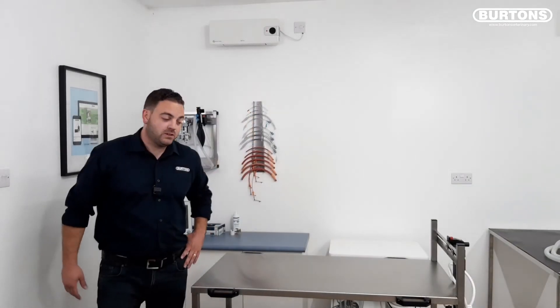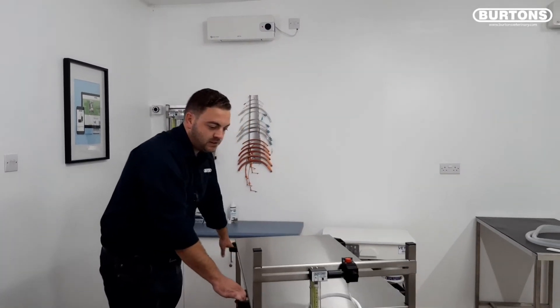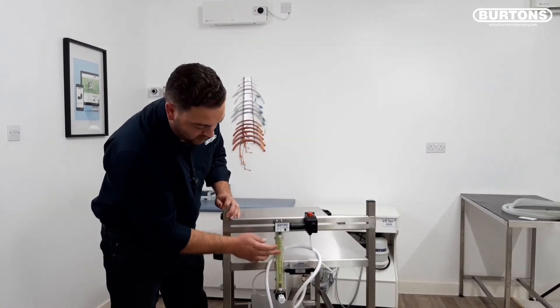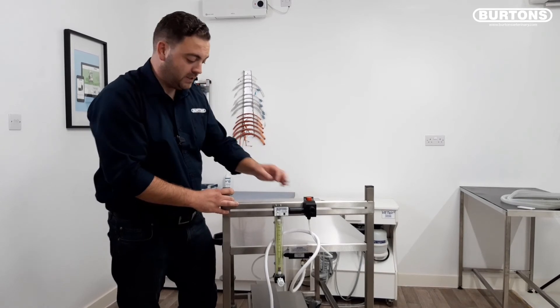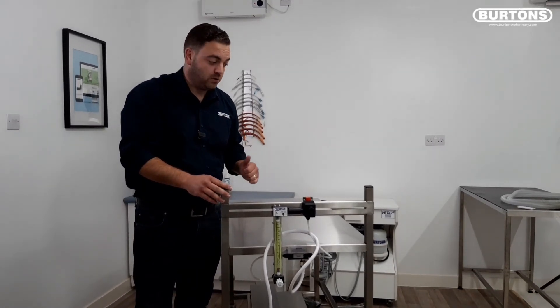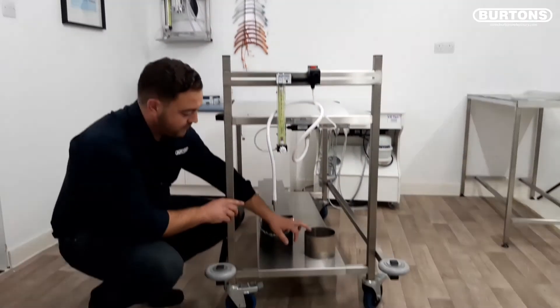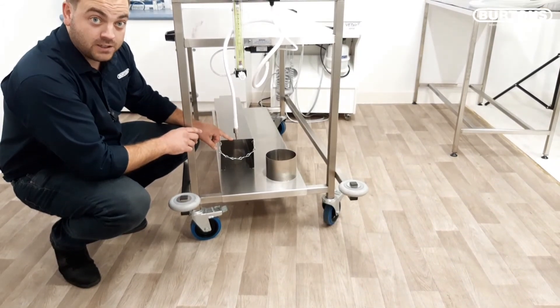Here we have the Burtons anaesthetic patient trolley. As you can see it's very manoeuvrable. It comes with a back bar at the top of the table with a high accuracy rotameter, vaporizer feed unit and corner O2 unit, so you can continue to do anaesthetics while on the move. It also has a space for an anaesthetic gas absorber and a cradle for an F size cylinder.